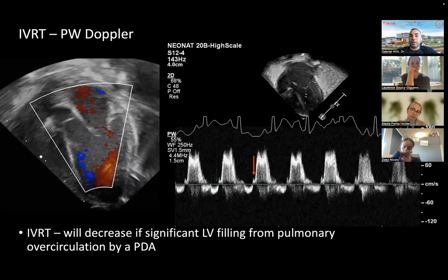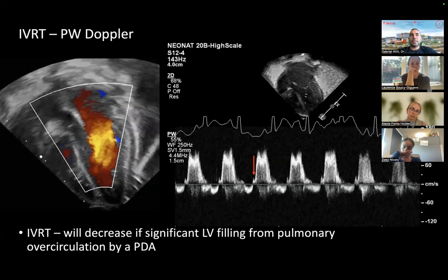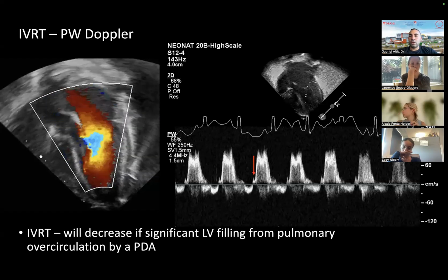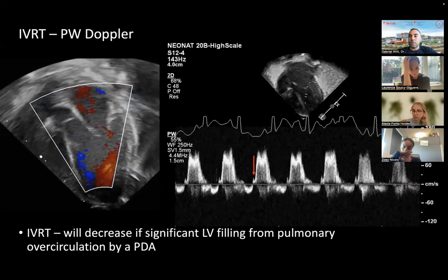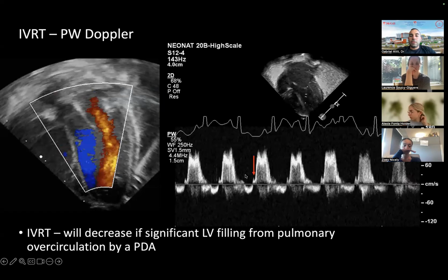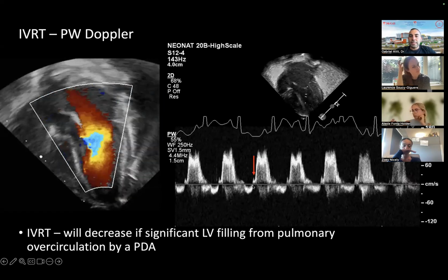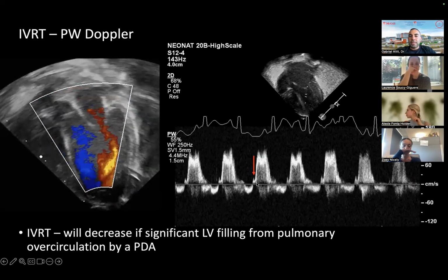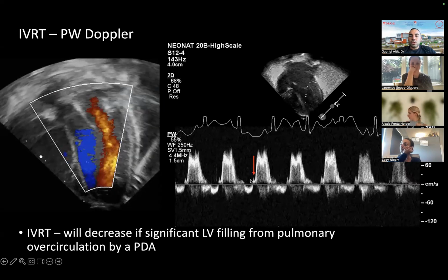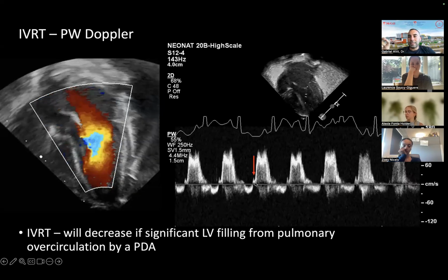It's something they also use in fetal life to calculate what we call the mechanical PR interval. You can read this on the NeoCardiolab website, fetal echo section, on congenital heart block for second degree or first degree heart block. That's how they measure the PR interval in fetal life. But basically, on this view, we capture a bit of the systolic ejection, which ends here, and then you capture the beginning of your diastolic filling, the early phase of filling, and eventually your atrial kick. So this little zone here is what we call the isovolumetric relaxation time.